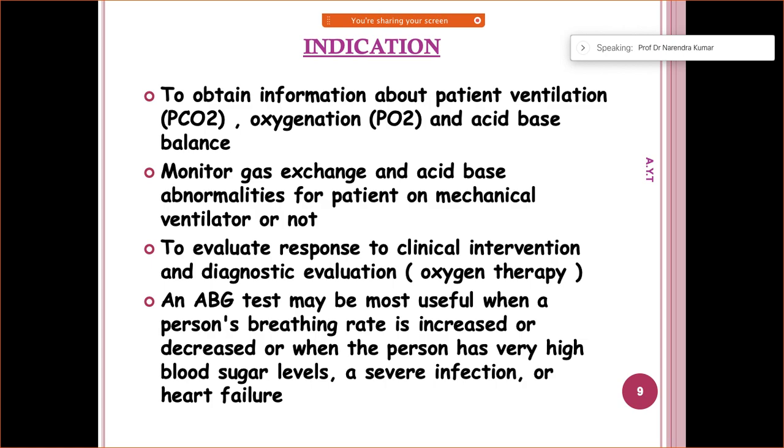And yes, if the blood sugar levels are very deranged, there's a severe infection, or even associated heart failure as well. So ABG has different components as well.